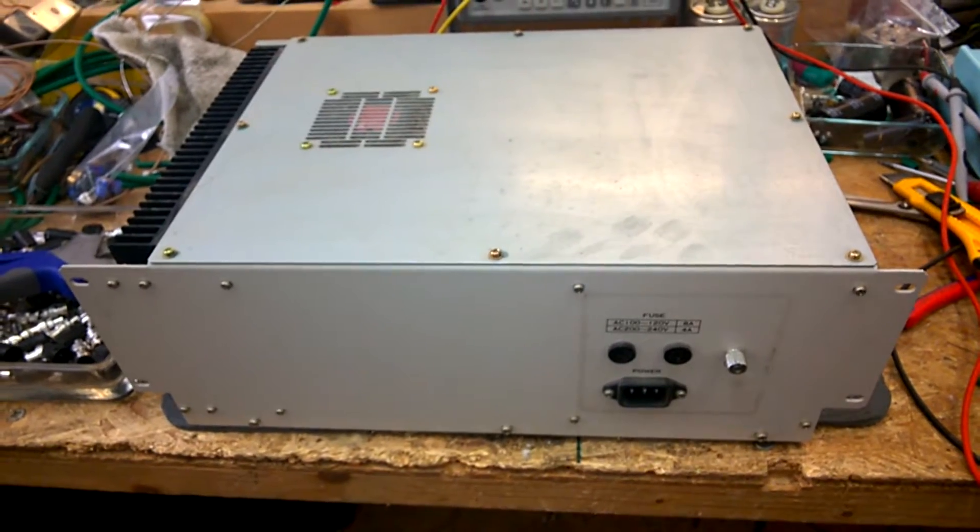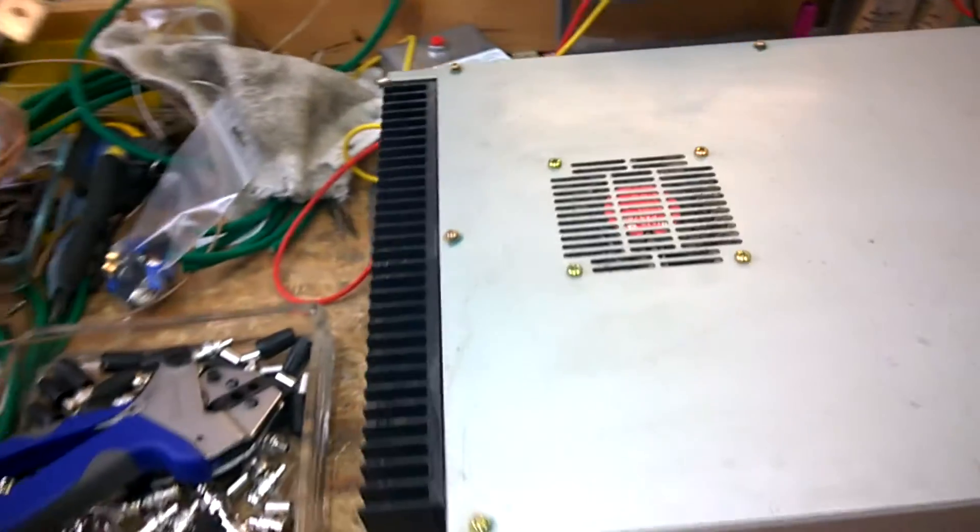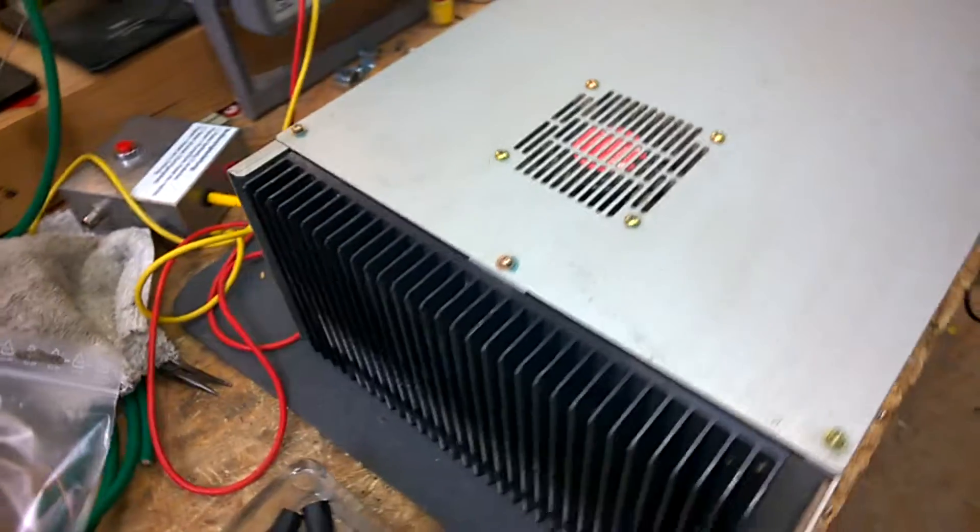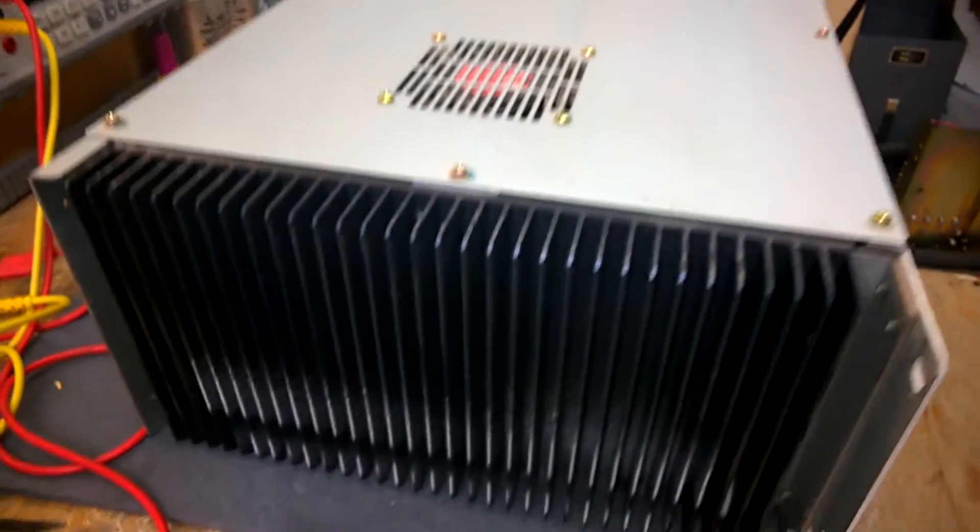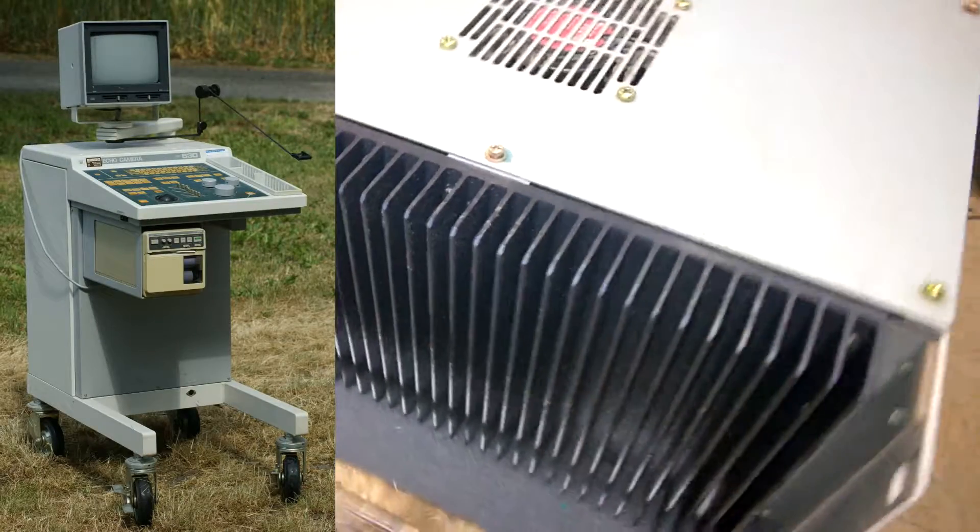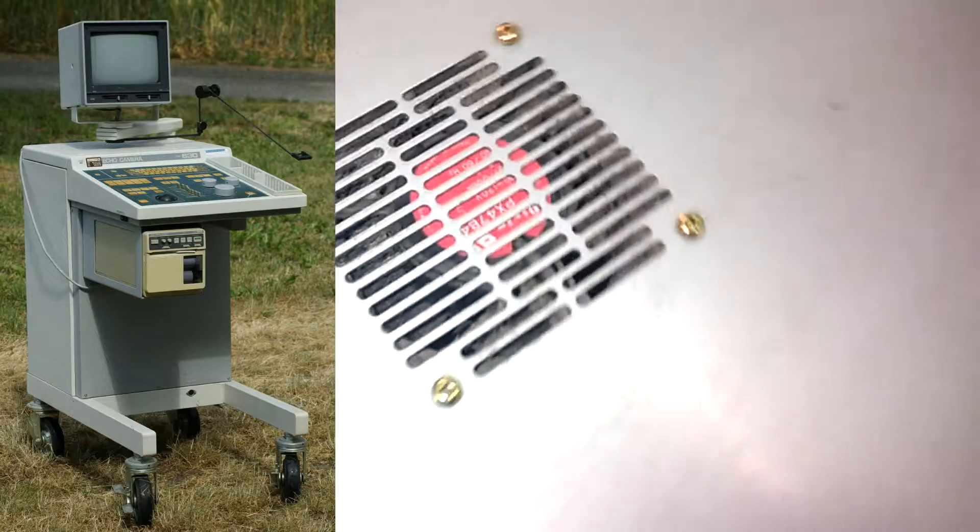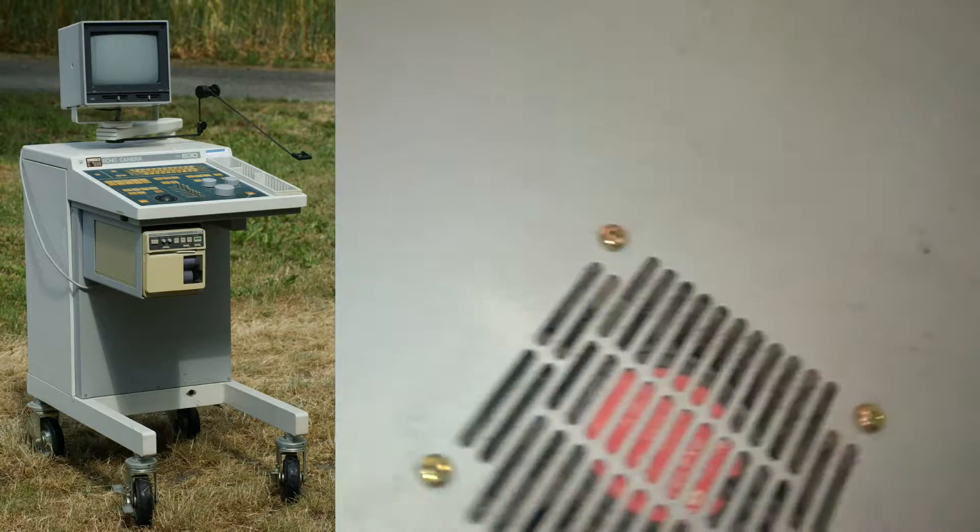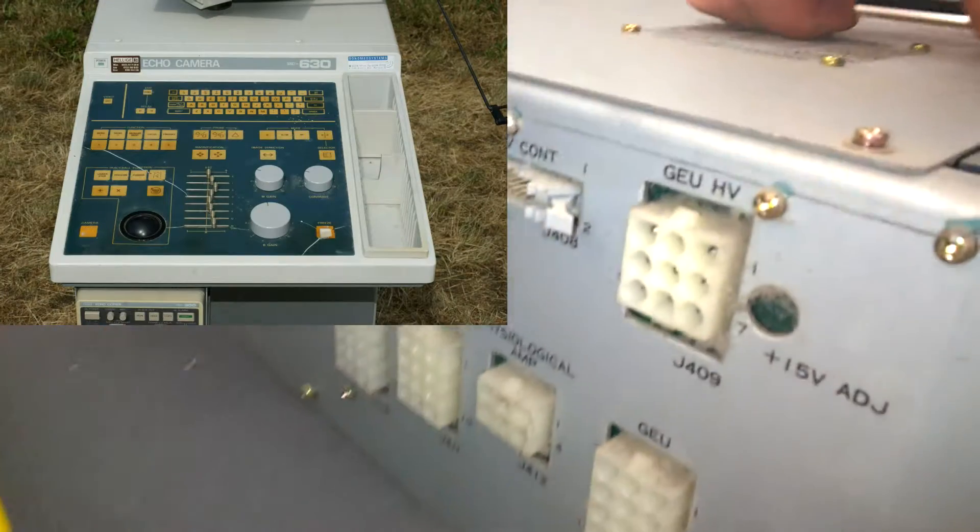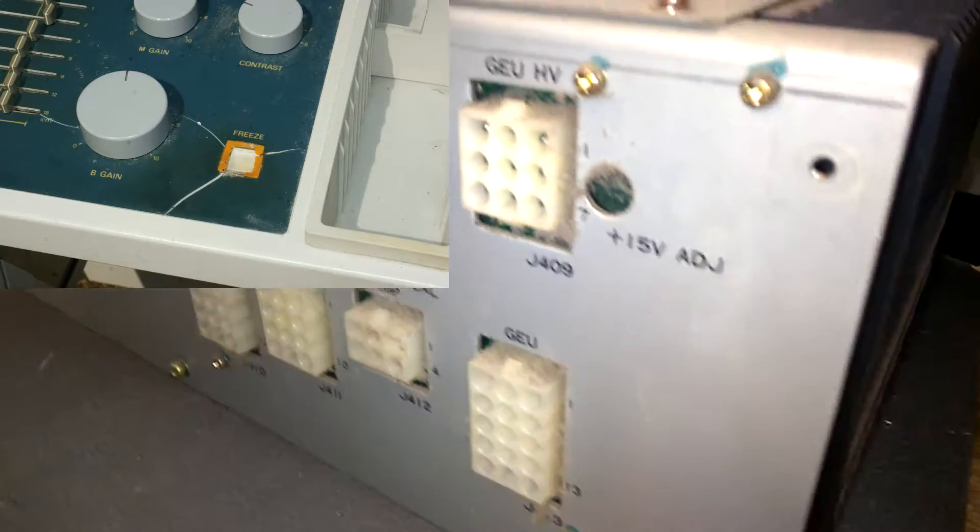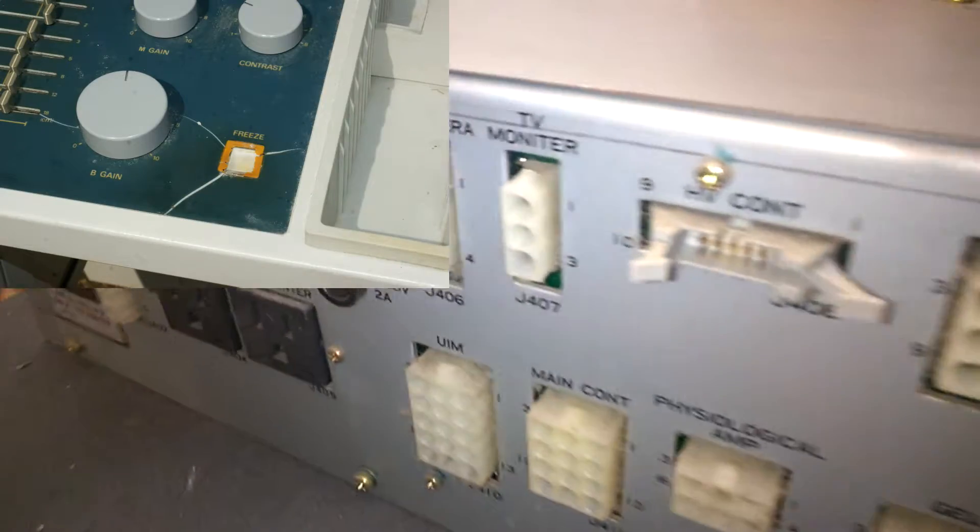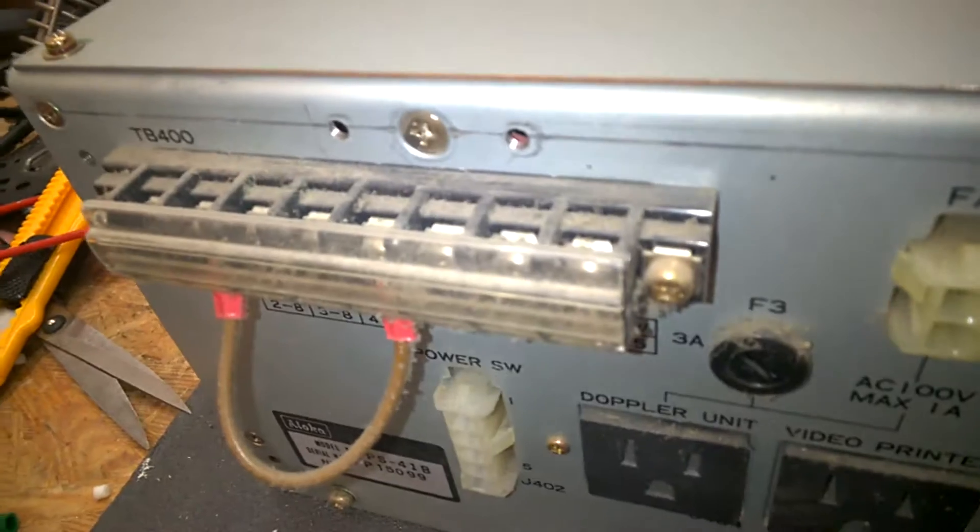This is a large power supply from an Aloka Ultrasound machine. I scrapped this a while ago. Unfortunately, I didn't make a video because I had no equipment to make videos at this time.